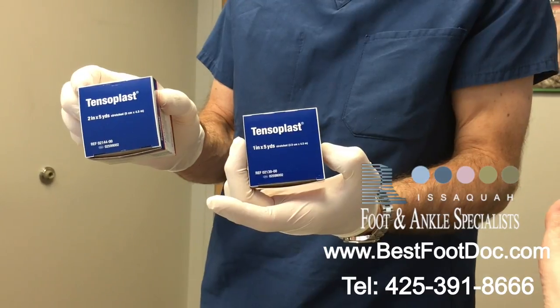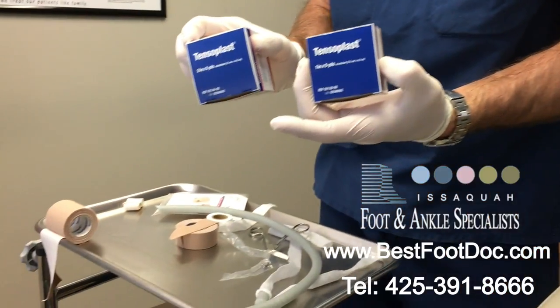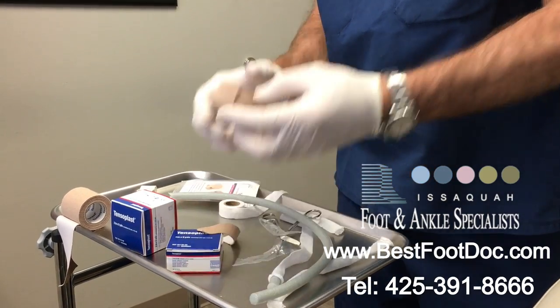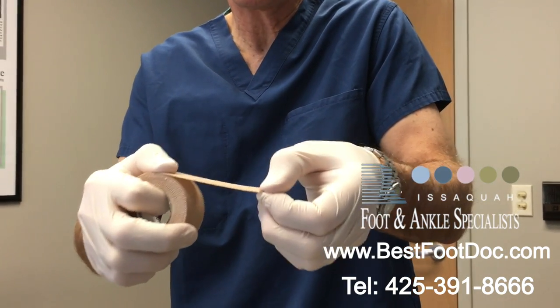And then you've got tenoplast. You don't have to use tenoplast — you could use another type of elastic gauze tape — but this is some of that tenoplast here. It's just a roll of elastic, stretchy, fairly thick tape.